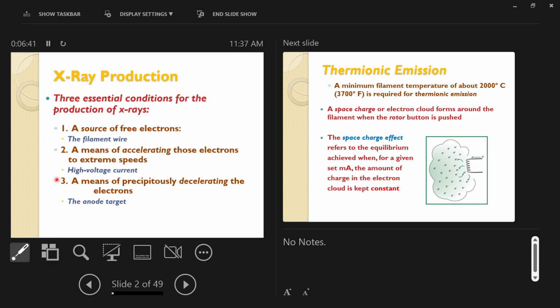and we want to take all of their energy away, and we want to use it to make X-rays, okay? That means we have to give them a lot of energy first. Electrons cannot get bigger. You can't give them more mass. What you can do is make them move faster. You can accelerate them. So we need to accelerate electrons and then slam them into a wall so we can use their energy to make X-rays.